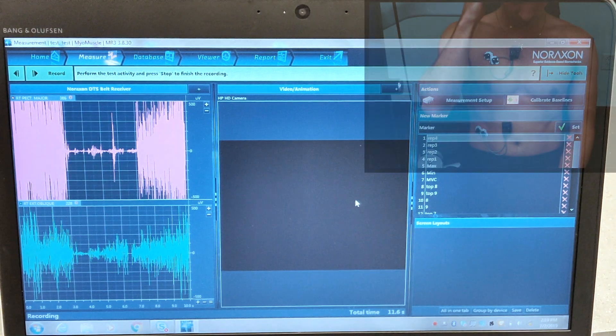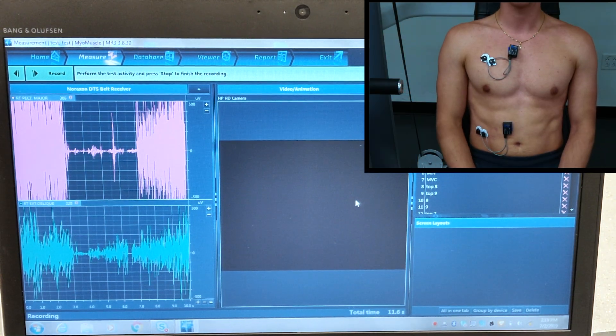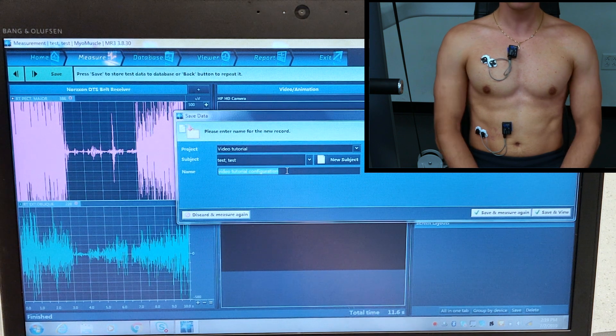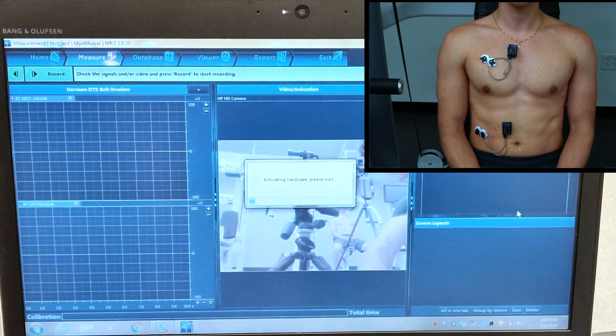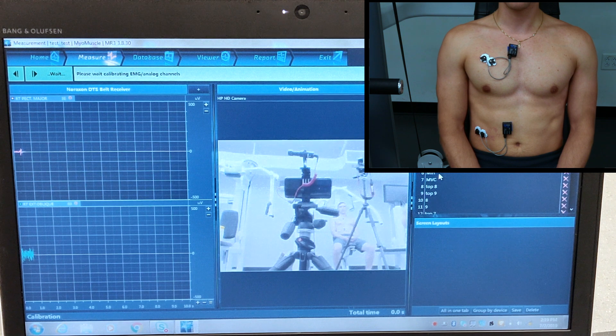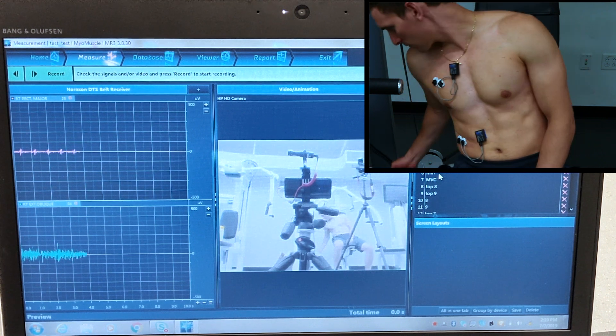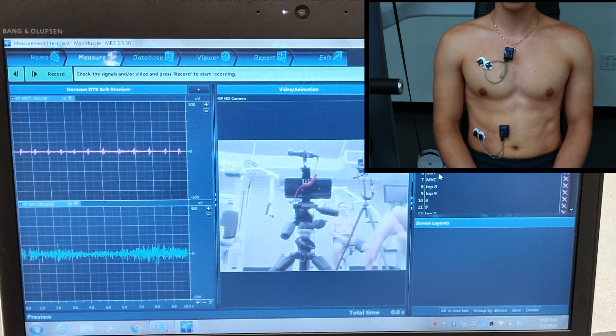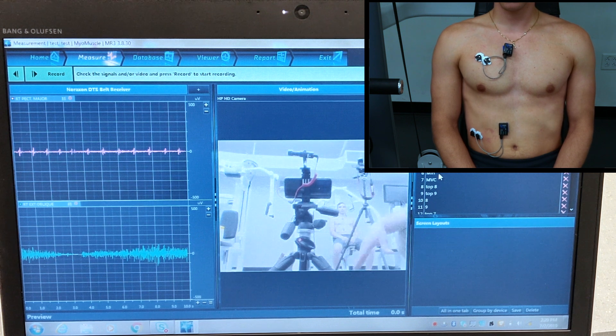We'll hit OK and it will give us a Save Data screen — we'll go ahead and label that save data as Test MVC. We'll hit Save Data and Measure Again. Now we could have the subject do a set of 5, a set of 10, or a set of whatever the experiment calls for, so that we can compare the contractions and the muscle activation to the original MVC.